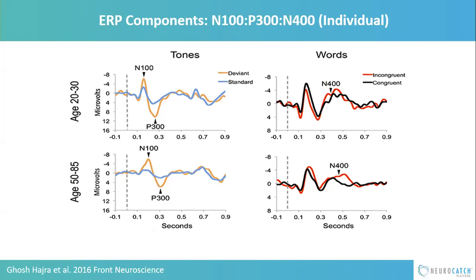But here, you can also see that you can look for the separation between the incongruent and the congruent. So you're really trying to look for airspace between these two. And when you see this airspace, again, in the N400, it's not always large, but it's always important. So the size is not what you're going for here, but the directionality definitely is something your eye is going to learn and train on to make sure the incongruent is showing larger than the congruent.